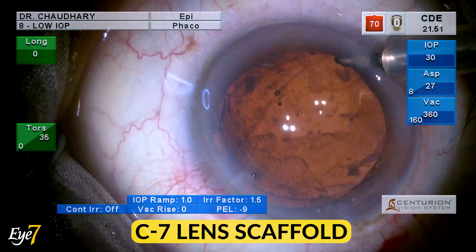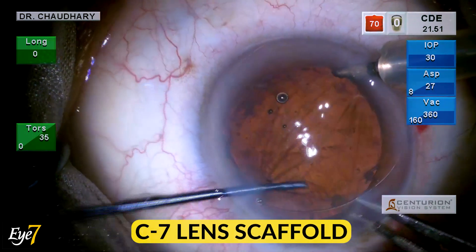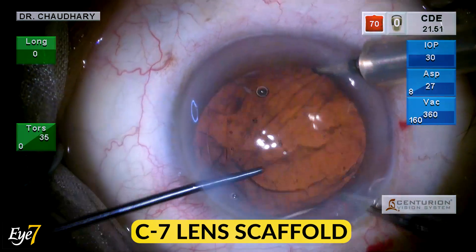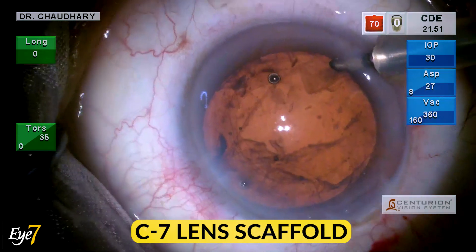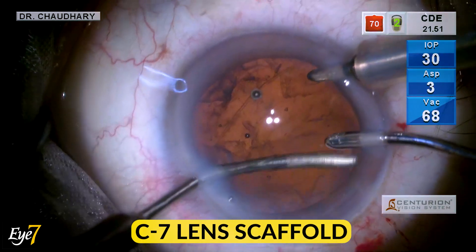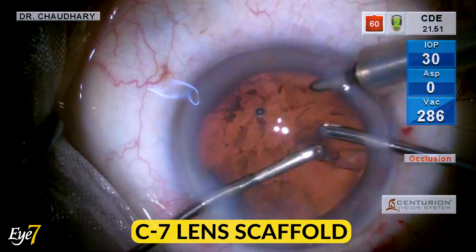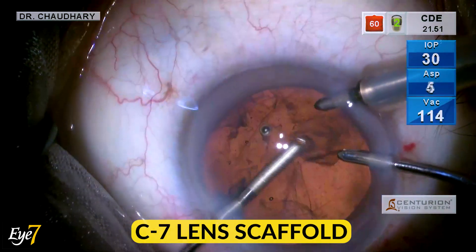Once this job is done, the lens scaffold can be held by any forceps and removed from the eye. The ACM maintains the chamber while we remove by bimanual I/E system the residual cortical matter, first from the area which is distal to the PC rent.